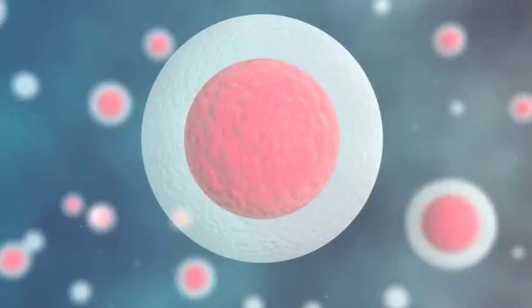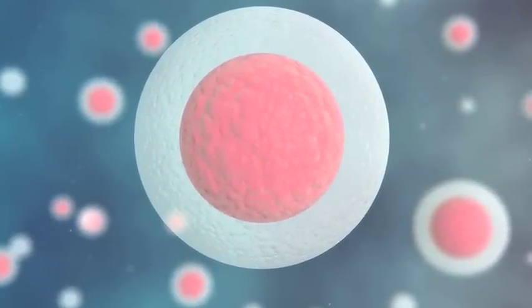Thank you for viewing this informational video on a non-surgical cow embryo flush.